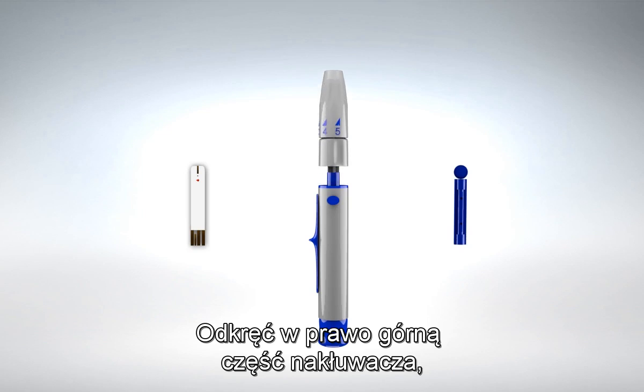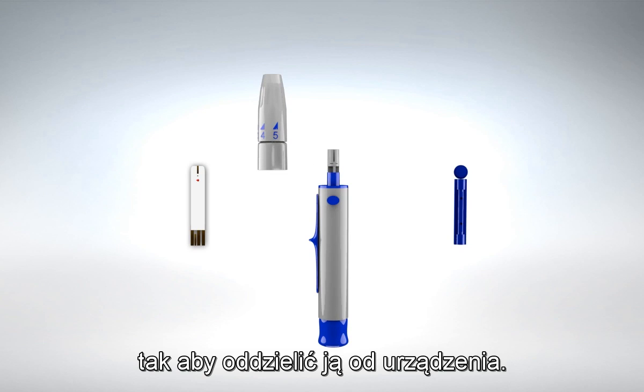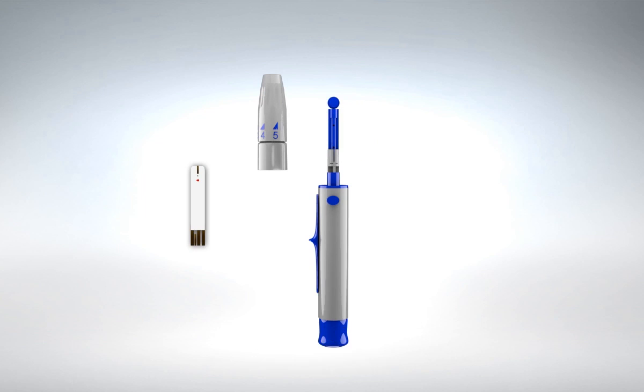Switch the upper part of the lancing device to the right, so it will be positioned above the blue line until it has detached from the device. Insert a new lancet into the white lancet holder cup. Hold the lancet firmly in place with one hand.